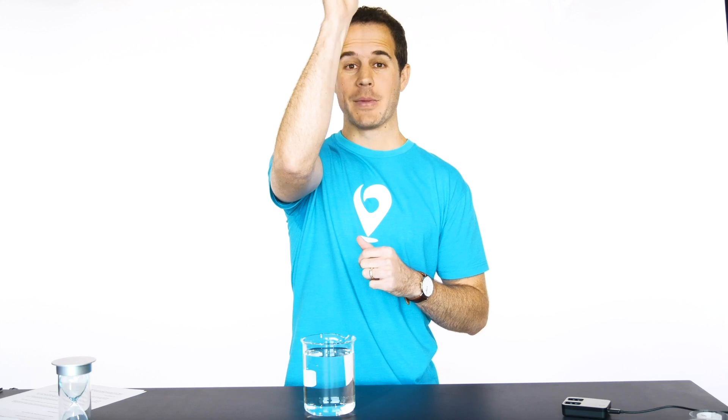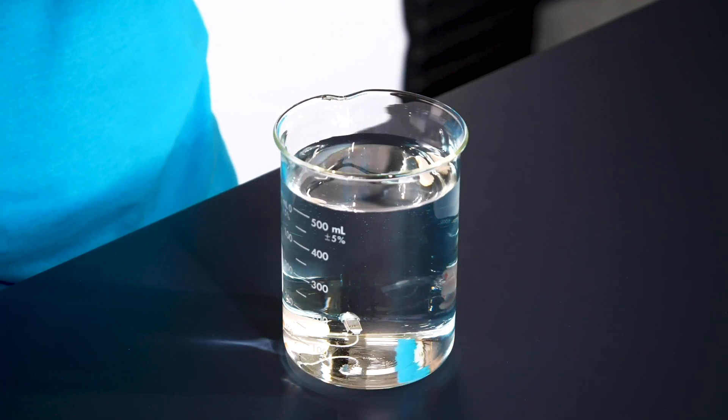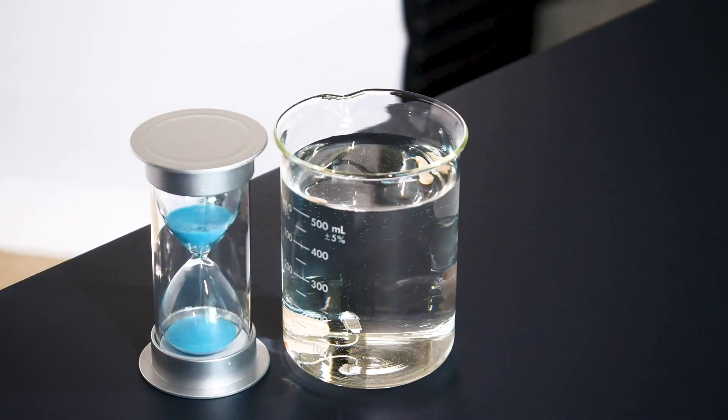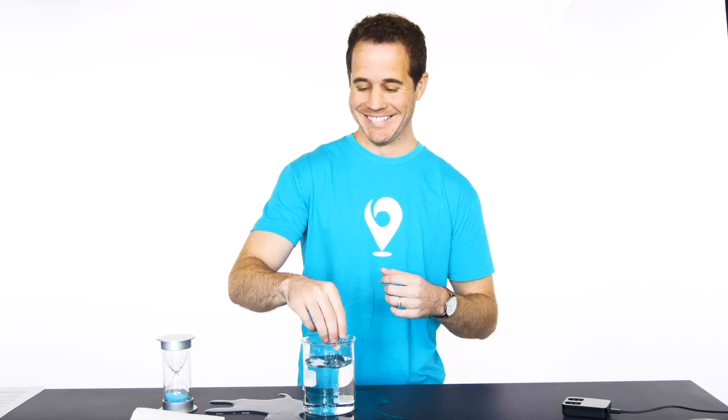This is a working hearing aid — hear that? That means it's working. Now I'm going to put it in water for 15 minutes and see what happens. We're just going to let it sit. That is 15 minutes. Let's pull it out and see what's going on. Can you hear that? It's alive.